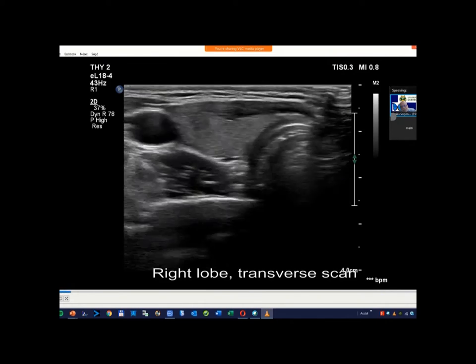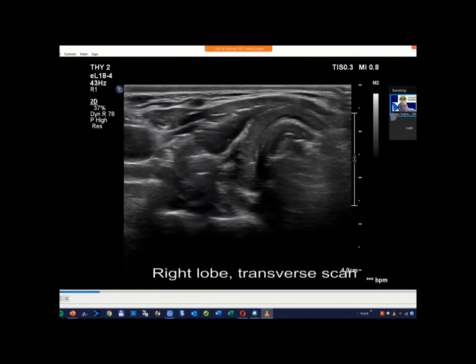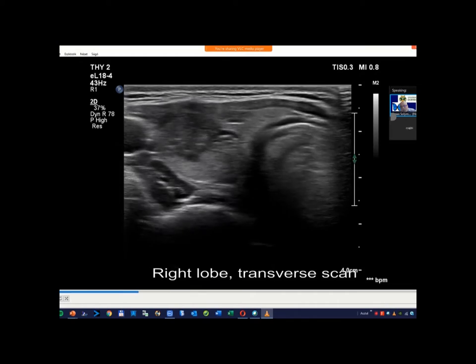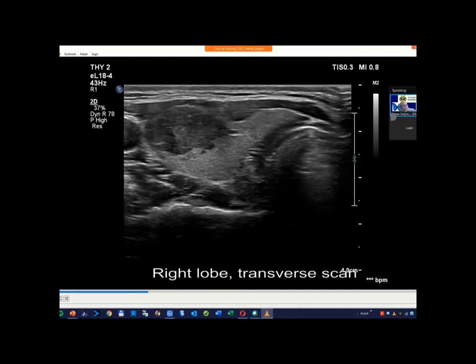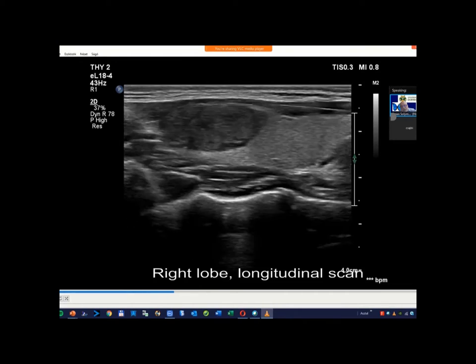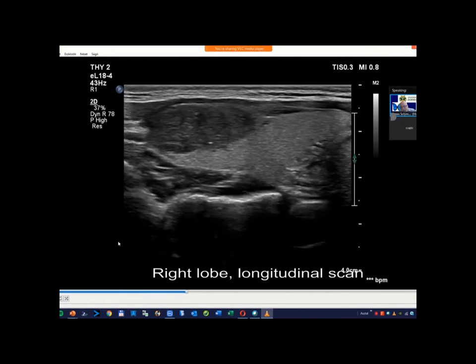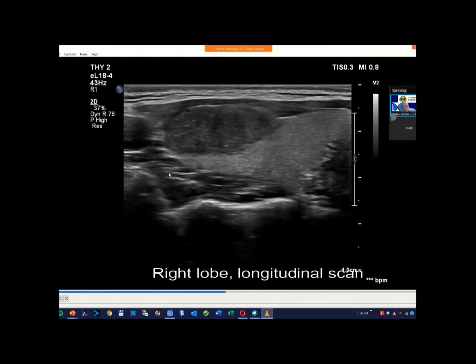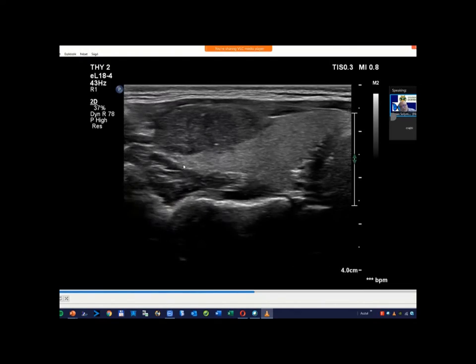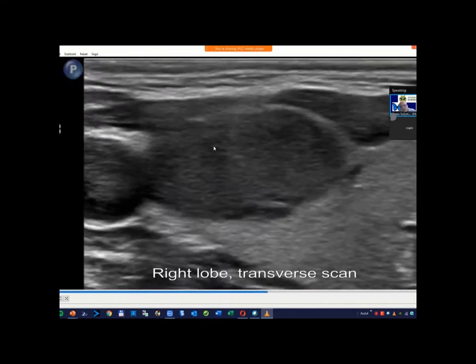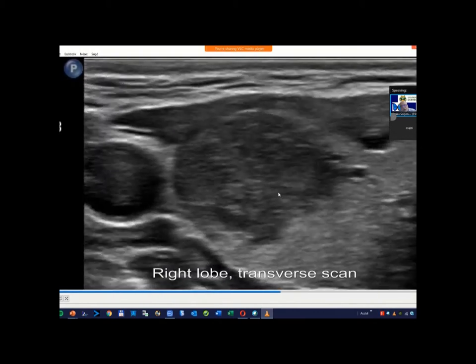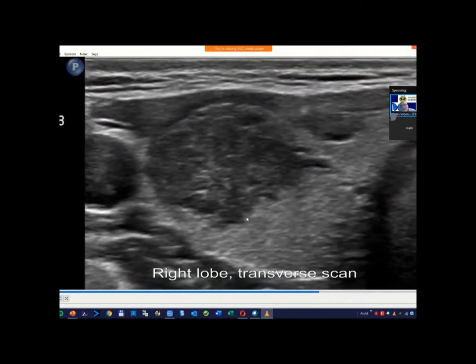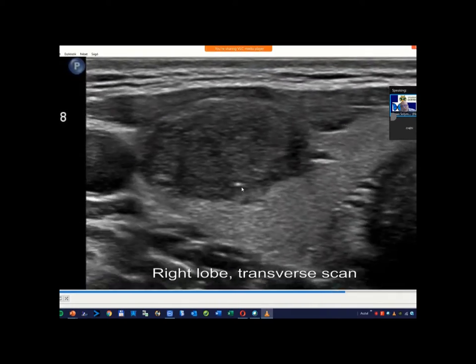This is not a classical pattern of microcalcifications, but this is the pattern which we most frequently meet in our everyday practice. This proved to be a papillary cancer, so viewing the histopathological results, these hyperechoic spots must be microcalcifications.